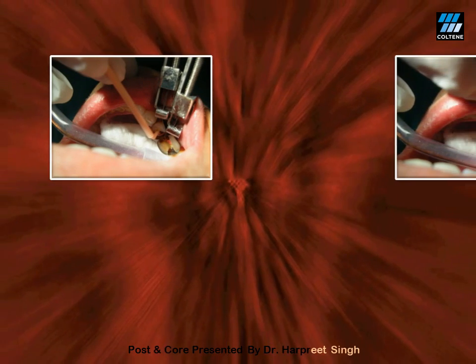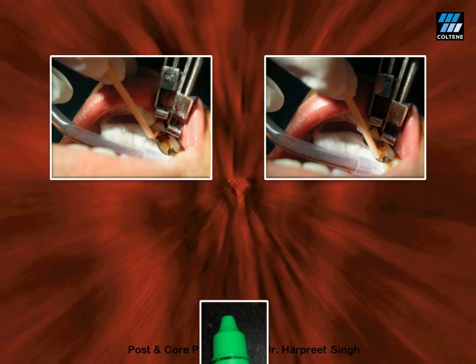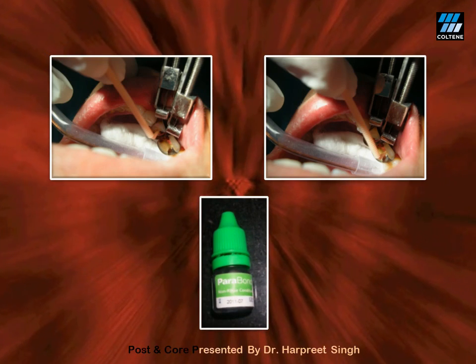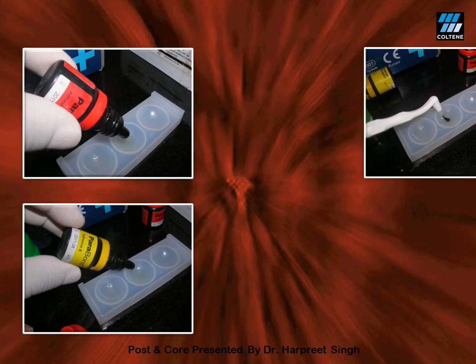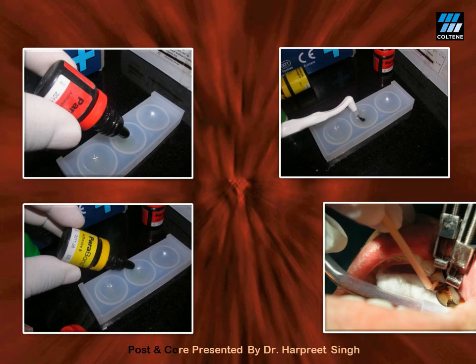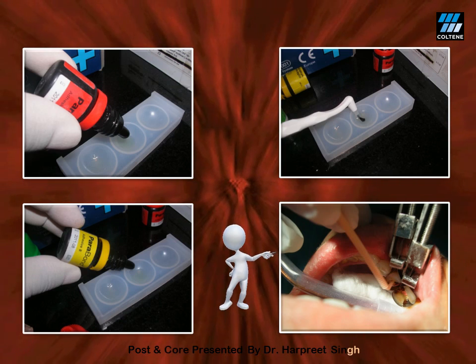After placing an appropriate matrix, a non-rinse conditioner is applied in the post space preparation as well as in the pulp chamber — in this case, NRC from the Paracore kit. Apply for 30 seconds on the dentine, then absorb the extra from the post space using paper points. Next, apply the chemically cured bonding agent: one drop of base and one drop of catalyst of Para Bond mixed in a mixing well, applied in the post space as well as the pulp chamber for 30 seconds, then absorb the extra using paper points.